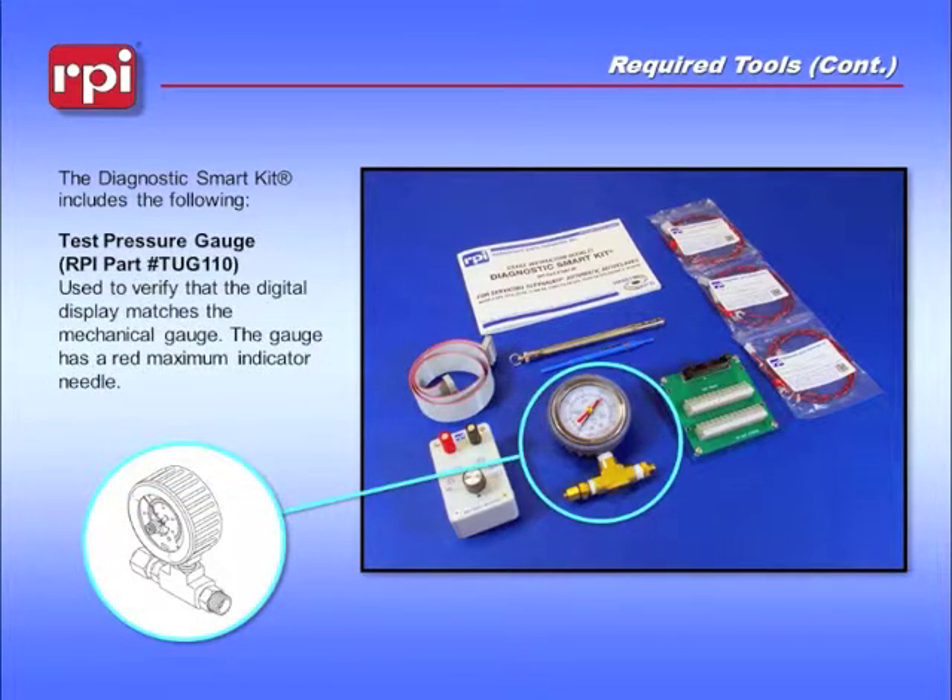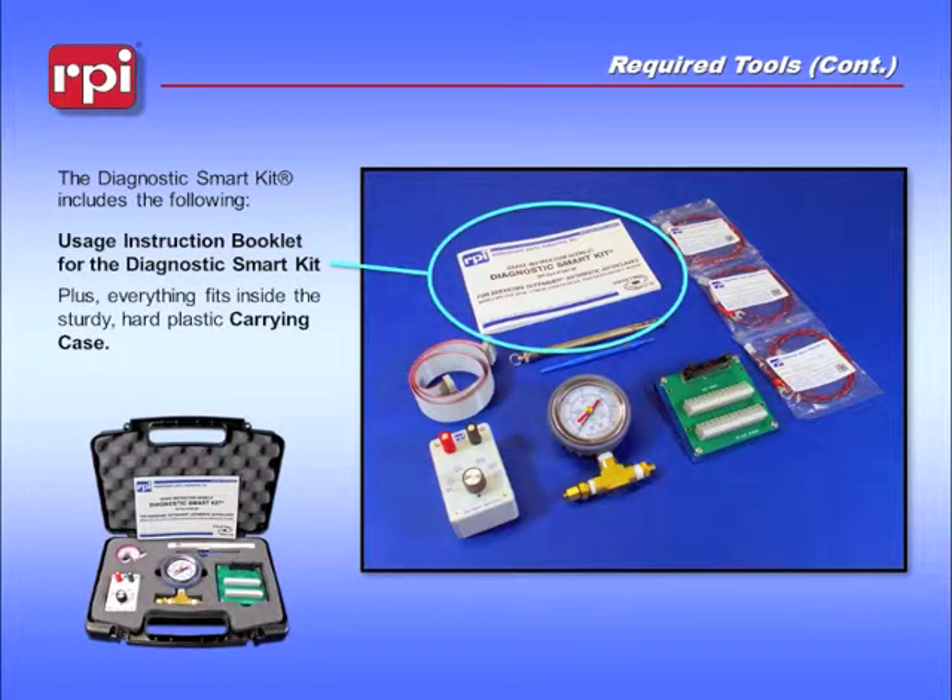The test pressure gauge, RPI Part Number TUG110, is used to verify that the digital display matches the mechanical gauge. The gauge has a red maximum indicator needle. The instruction booklet can provide several hints and tips for troubleshooting and calibrating your E-Series Tuttenauer.